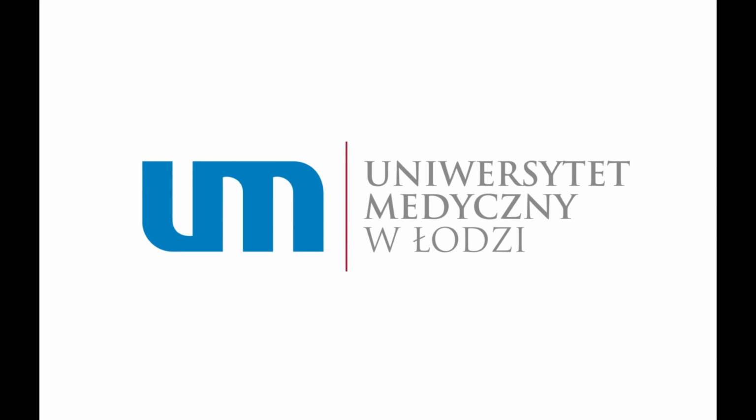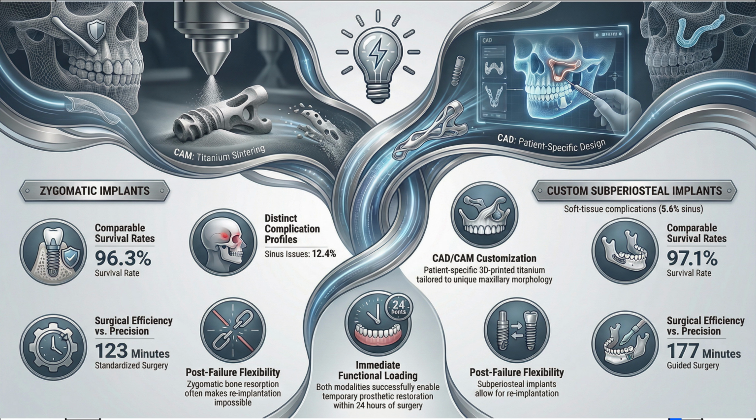In this explainer, we're going to distill the findings from a really important 5-year comparative study published in the Journal of Clinical Medicine. We'll be looking at 2 advanced implant solutions designed for the very specific challenge of severe maxillary atrophy. And what's particularly significant here is that this study analyzes what is currently the largest cohort of subperiosteal implant cases in the entire worldwide medical literature.